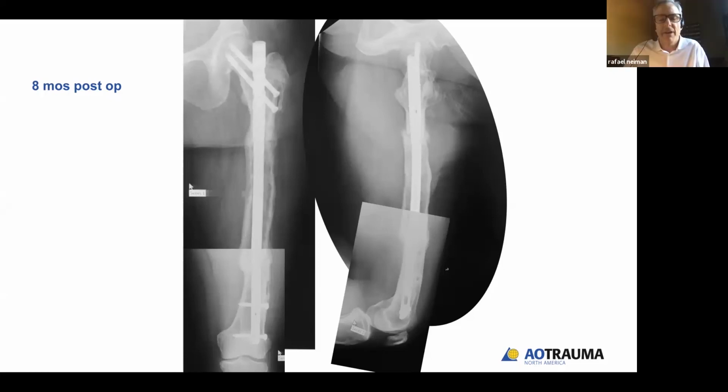Well, some final thoughts. Steve, you've given me advice on this before with motorized nails, but I think the same thing applies to any metaphyseal nailing, and I think Matt makes this point: having screws around the nail, or additional crosslocks through the nail, beyond just the two that are in there. You need at least two. This is not a simple fracture. The screws have got to last a long time.